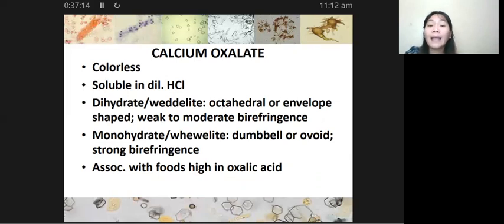We have the dihydrate form, and then we also have your monohydrate form. Depending on whether we are talking about your dihydrate calcium oxalate or monohydrate calcium oxalate, magkaiba yung trivial name na meron po sila. Dihydrate calcium oxalate is otherwise referred to as your Wedelite. Pakibilugan ang letter D kasi that will help you memorize it easily. So dihydrate, Wedelite.